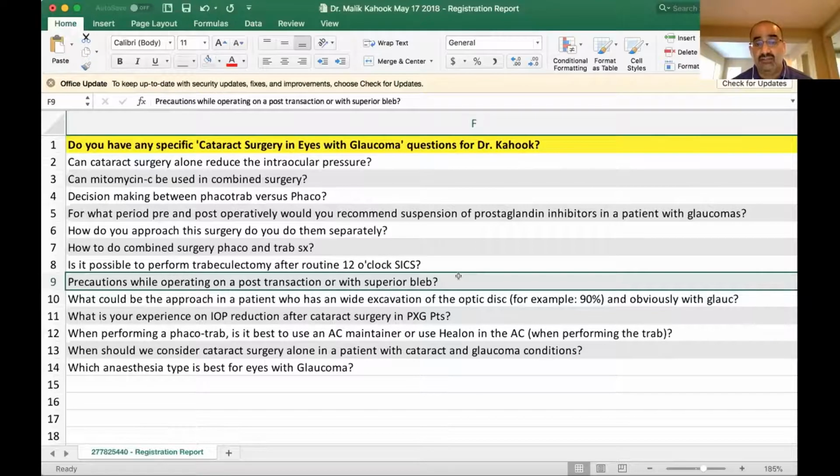One thing I will add here is if you're going in and doing cataract surgery on a patient who does have a bleb, at the end of the cataract surgery, it might help to needle or to tease away some of the scar tissue in that bleb at the end of the case. A very elegant way to do that is to get a cyclodialysis spatula, fit it in through the clear corneal incision that you use for the cataract surgery, and then bring the distal end of that cyclodialysis spatula through the sclerotomy, work your way into the bleb, and you can actually lift up the scar tissue from an ab interno approach, lifting up on the Tenon's capsule that might be scarred down.